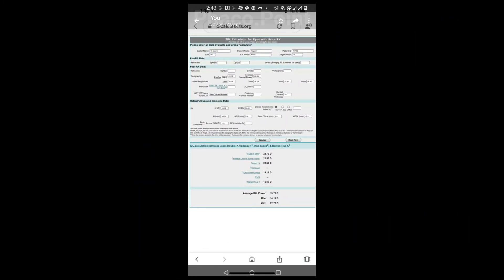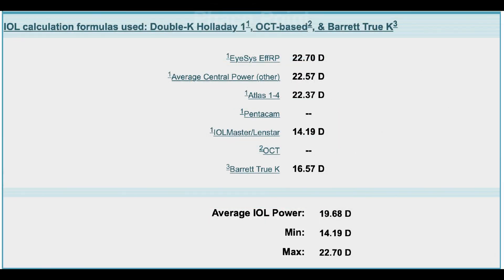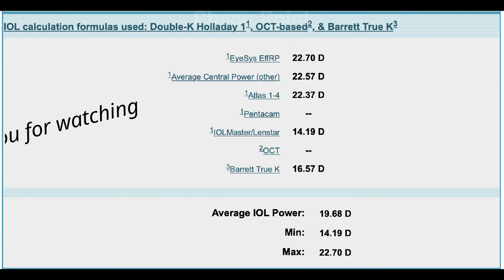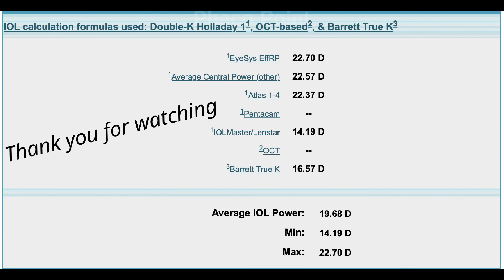In the lower part of the page, you will see about five formulae, most of which do not require any previous data — just your topography and optical biometry. It gives you five different values based on five different formulae. Finally, it also gives you a maximum and a minimum, and then suggests what is the average power the surgeon can consider choosing. This completes the tutorial on IOL power calculation in eyes that have undergone a previous radial keratotomy.